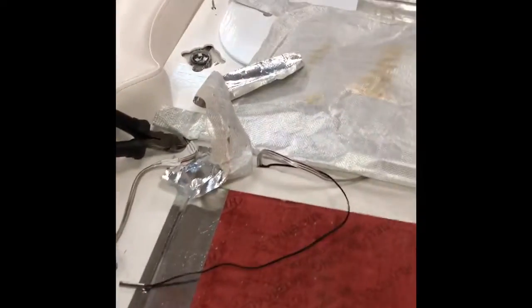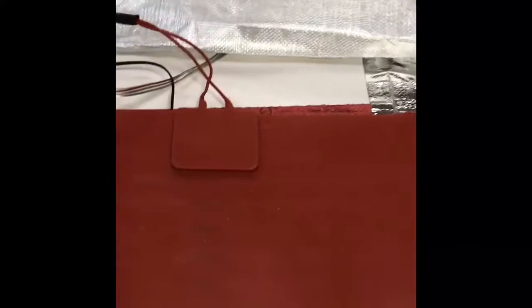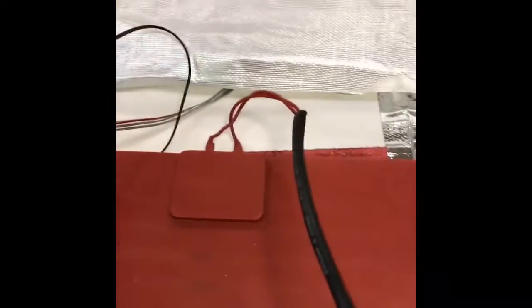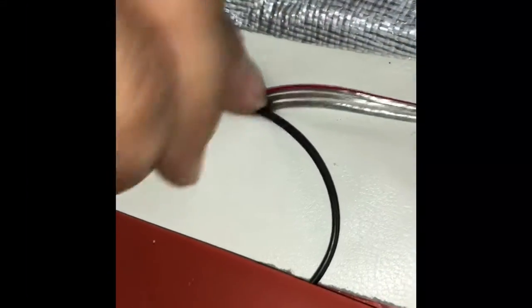An example, let's just say this is a new one, and you're gonna basically be doing the same thing. You're gonna put the new one back in here, and you're gonna go ahead and put the wires right back into that hole right over here. And you're gonna push it down a little bit, about 3 to 4 inches down. And we're gonna go back right over here.